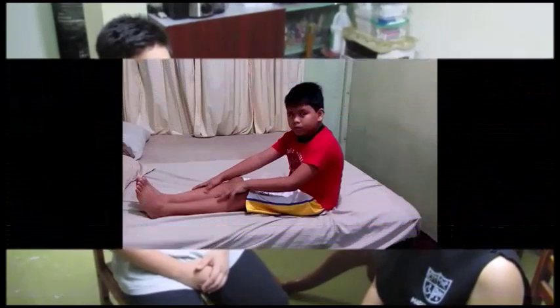The normal response will be if the degree of tilt was within 1.5 degrees from the true vertical, and an abnormal response will be if the degree of tilt is more than 2 degrees from the vertical. Lesion site will be dictated to the site where the tilt was made. That's all.